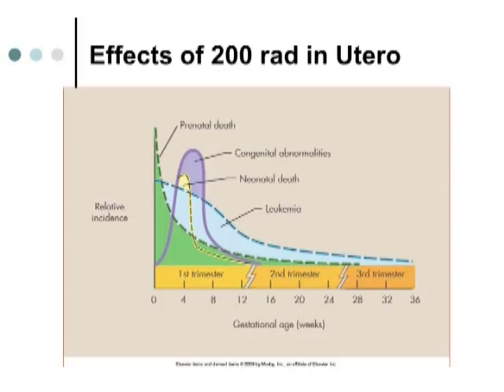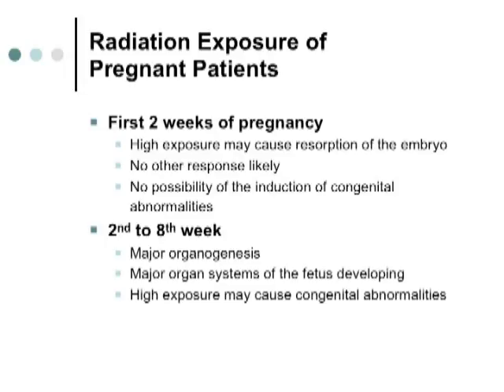So I remember back in the 70s and 80s, before ultrasound really took off, we used to x-ray women for breech to see if the baby was breech, do a KUB, or sometimes be called up to labor and delivery and do a KUB on a patient that maybe was having difficulty. Now all of that's been replaced by ultrasound, right, which has no exposure to it. But anytime you expose a child or a fetus, there's an increased risk both for leukemia and later on in life for solid tumor to develop, up until about the age of 20, the latency period.